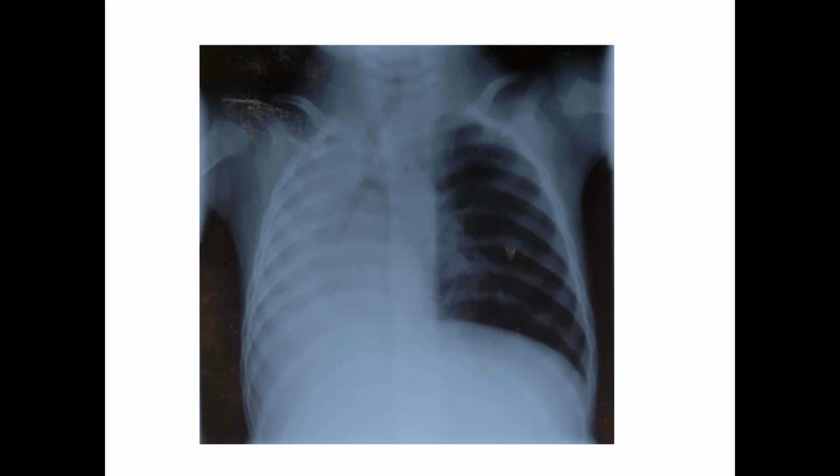Specifically, you can see bone pretty well with X-ray. There are some masses that will show up pretty well. If you have a mass that you suspect shows up on a chest X-ray, then they may look at ordering a chest CT or something to that effect, something that's going to give them a little bit better look than what the standard chest X-ray is going to give.